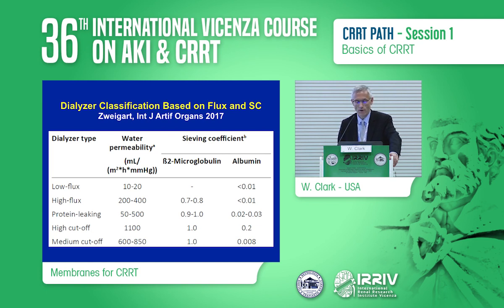Now, you'll notice that these water permeabilities are very high. You'll remember that I mentioned before that the KUFs typically reported, for instance, when you open up a box of filters and read the directions insert, are based on blood being used as the filtration fluid. In other words, it takes into account secondary membrane effects and so on. These are pure water permeabilities, virgin membranes that haven't been exposed to proteins, and that's why these numbers are so much higher than what you typically see for clinical KUF.